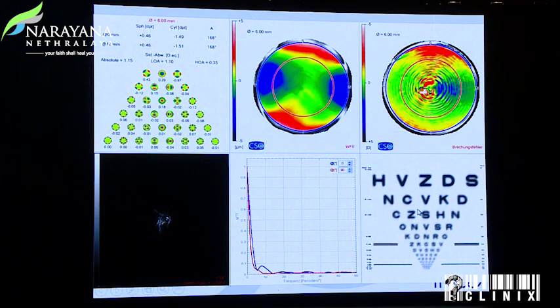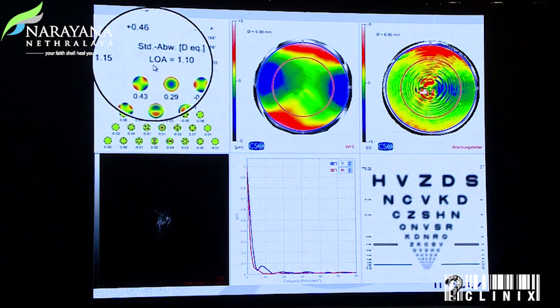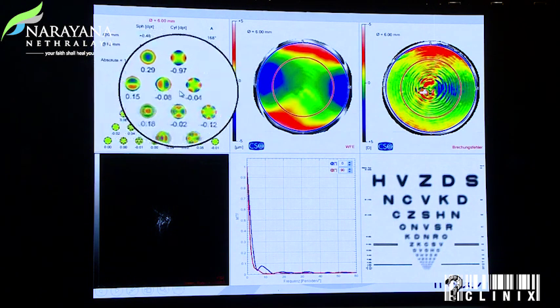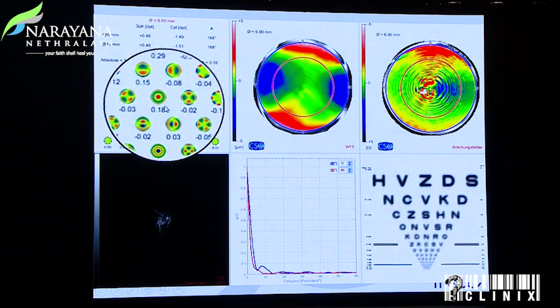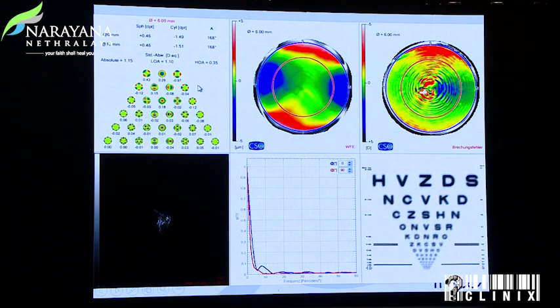So now, since we do have a selective wavefront guided treatment, we could go on and do all of this, taking all those aberrations, like here, sphere, low order, and astigmatism, but also coma, because the lens was slightly decentered. You do have trefoil, maybe due to shrinkage of the capsule. You do have spherical aberration, maybe due to apodization. Astigmatism of second order, all those things you can have. And that's what we did then.